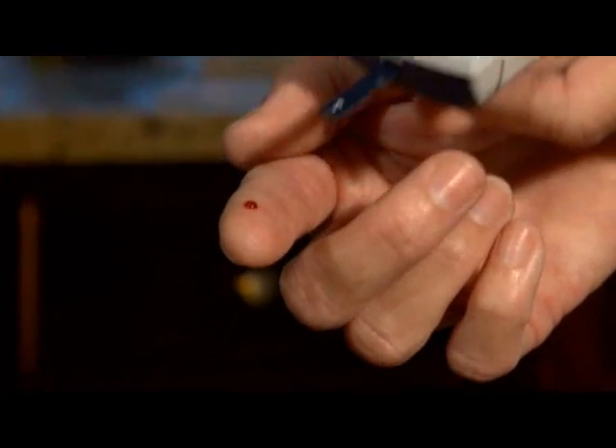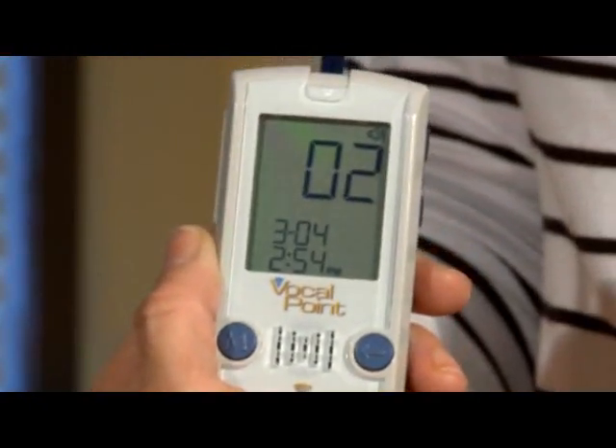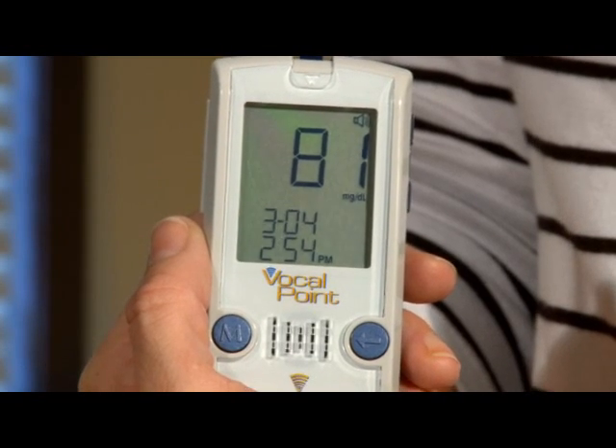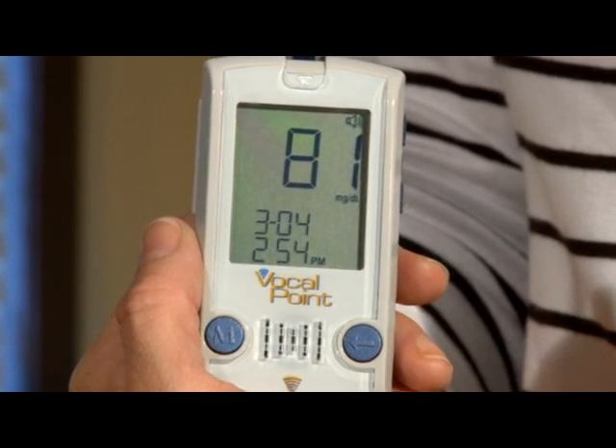Holding the meter at a slight angle, touch the tip of the test strip to the drop of blood, holding it there until the meter starts the countdown from six to zero. For proper technique, hold the strip to the site for several seconds to assure you get the proper amount of sample. After six seconds, your glucose result is displayed.